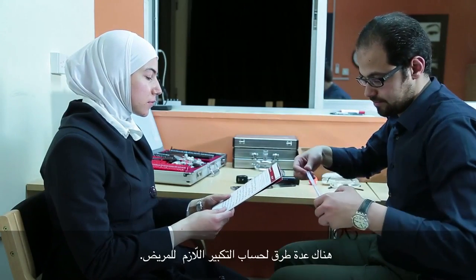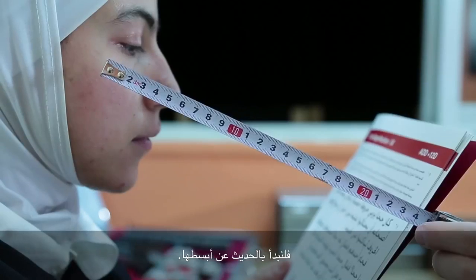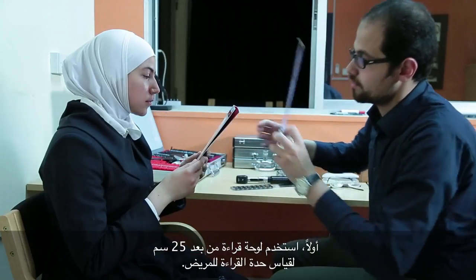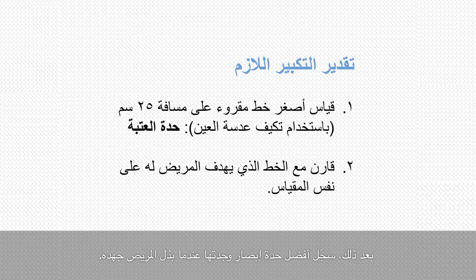There are many ways to calculate a rough idea of how much magnification our patient needs. Let's run through the simplest one. First, using your reading chart at 25 centimetres, measure the acuity of your patient. Now, 25 centimetres can be closer than you think, and you may need a ruler to check that you get the distance correct. You may need a reading addition when testing older patients or patients with little or no accommodation. Then, we're going to record the best acuity, measured when the patient is really trying.